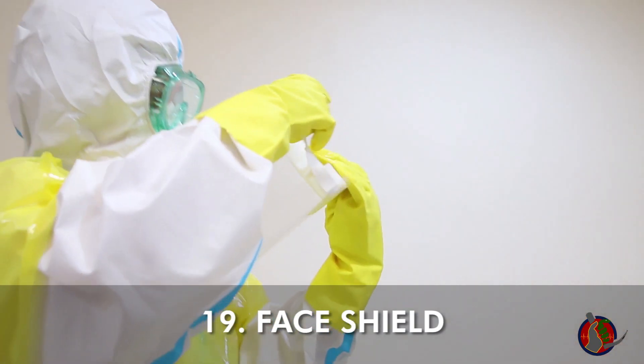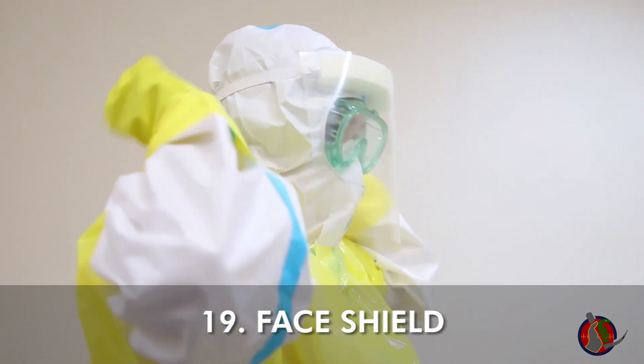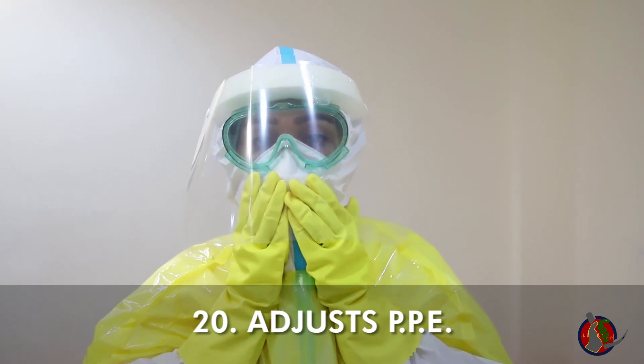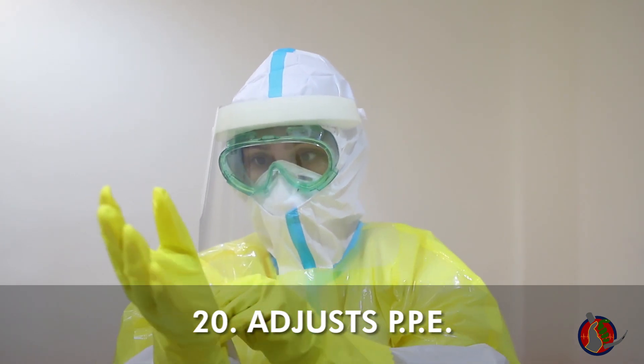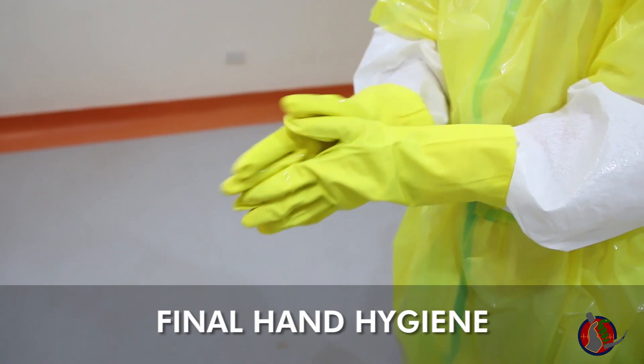Put on face shield. Skip this step if you're using a full face respirator or PAPR. Adjust hood by pulling slightly up to maintain view. Adjust everything at this time. You have now donned all three layers of the enhanced PPE.